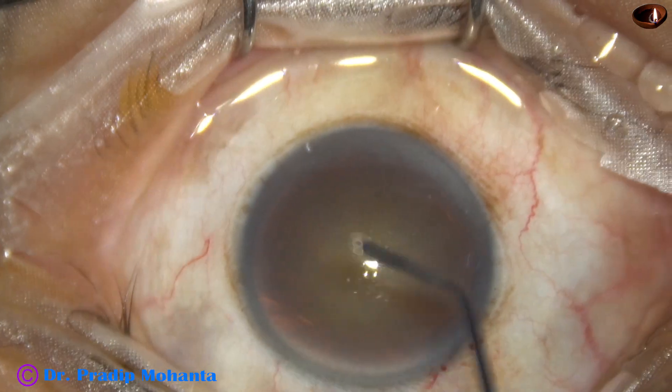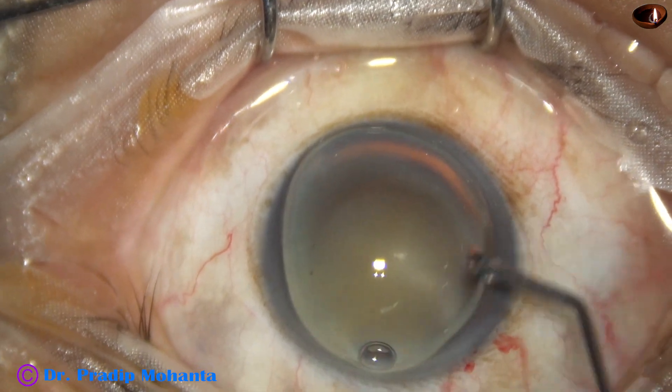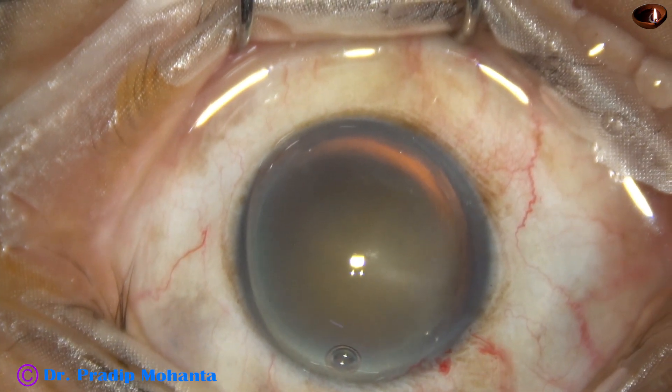Then visco, that is 2% HPMC, is injected into the anterior chamber, and it is applied over the cornea for better visibility.